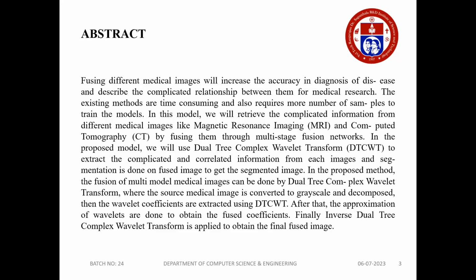In this proposed model, we'll use dual-tree complex wavelet transformation to extract the complicated and correlated information from each image, and segmentation is done on the fused image to get the segmented image.